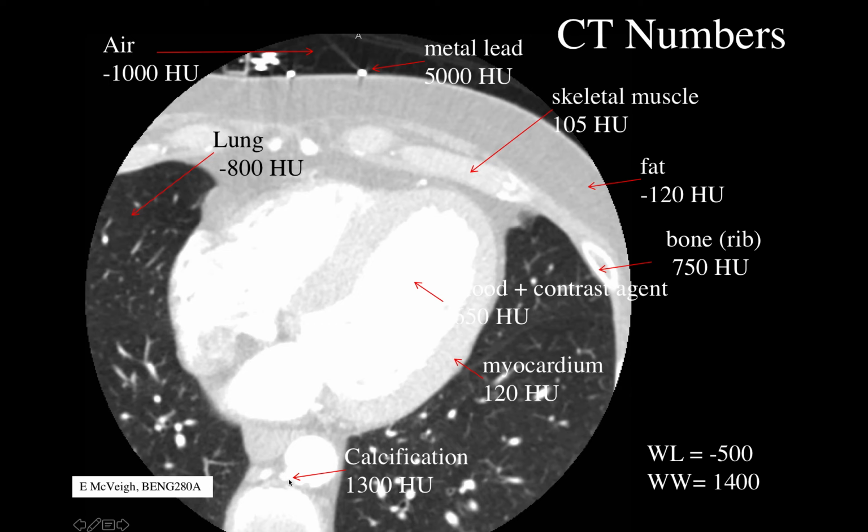But if your spatial resolution is sufficient, what we're talking about here is whether you can estimate the Hounsfield unit or the mu value, because you can map it back to an actual mu value for each position using that calibration equation. Inside that voxel, I've estimated the mu value. And in calcium, you're right, it changes a lot. It depends on the density of the calcium, and sometimes on the partial volume, because calcium can be very small, right? And so that'll change quite a bit.